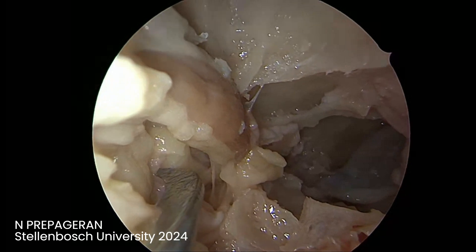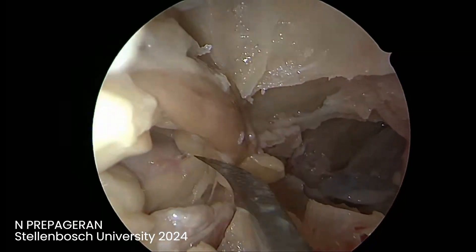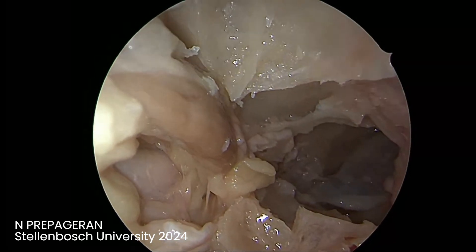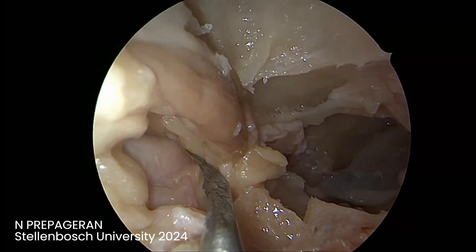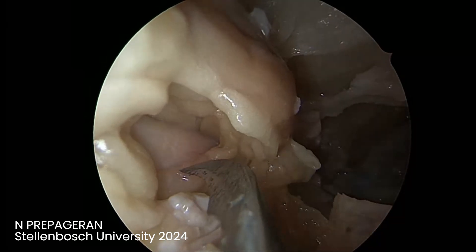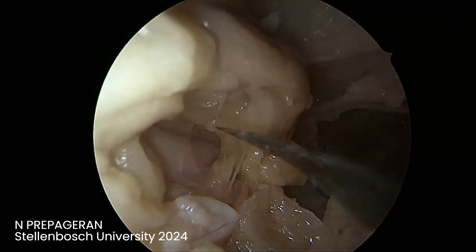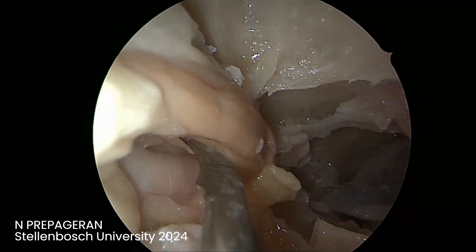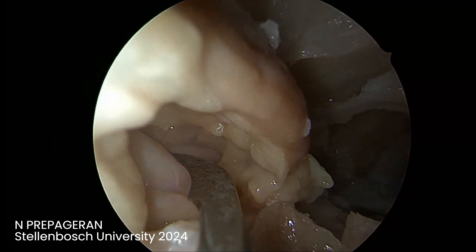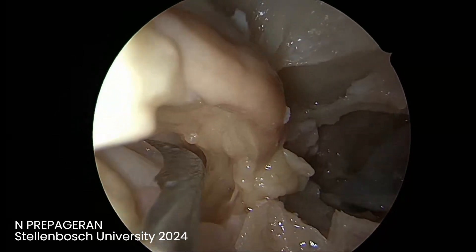That's a vessel — branches from the ophthalmic artery. And that's the optic nerve. This makes up for the hard bone. That is the orbital apex. This is how we do our intraconal work. We had 14 cases and published our series in 2014 — intraconal orbital tumors approached transnasally. Now you can see the orbital apex. I'm going to go above the optic nerve, dissect it, and expose almost 270 degrees of the optic nerve. You can also go below the optic nerve, though the ophthalmic artery branches are there.